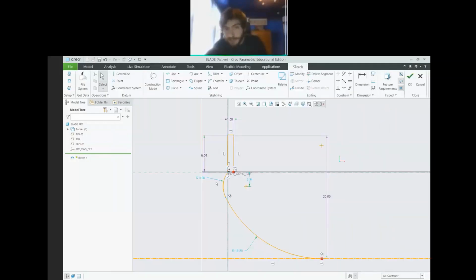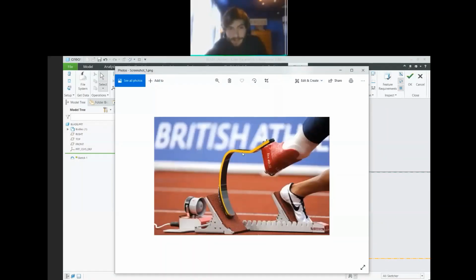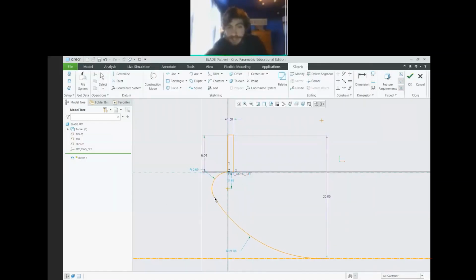All right, the other thing I'm looking at now is this curve that bends backwards a bit. We can see we're accomplishing that by how far left or right we drag the end of this first curve, and we can change how it looks up and down. The easiest way to do that, using another constraint type, is the coincident constraint, which allows you to pick two points or two lines, and they merge together. So now this point is always going to be on this vertical line, so we can only drag it up and down now.